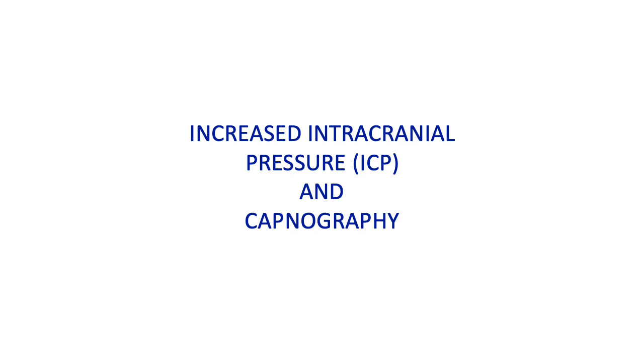Talk a little bit about increased intracranial pressure and capnography. If you look at what we've done for head-injured patients over the past 30 years, we've gone from hyperventilating patients thinking it's going to help them with a better outcome to just ventilating them normally as if they were breathing normally. So our goal now is to measure capnography in a head-injured patient and keep capnography levels in the normal range.